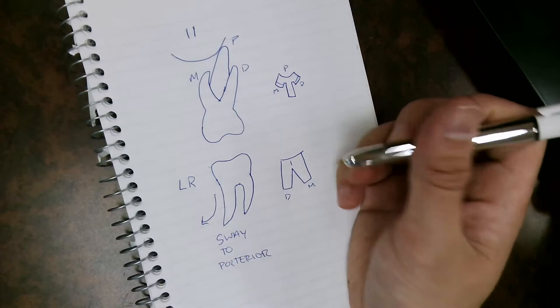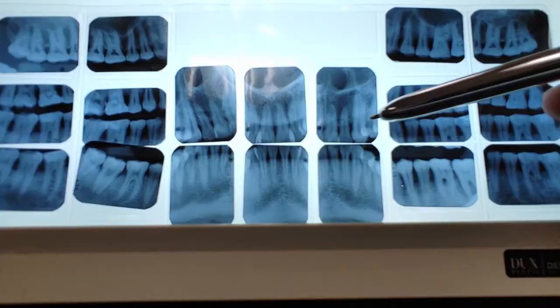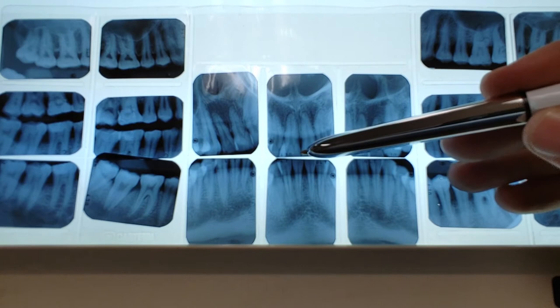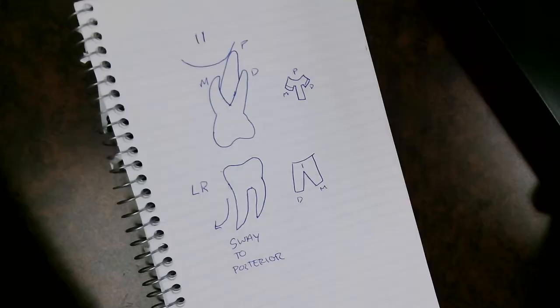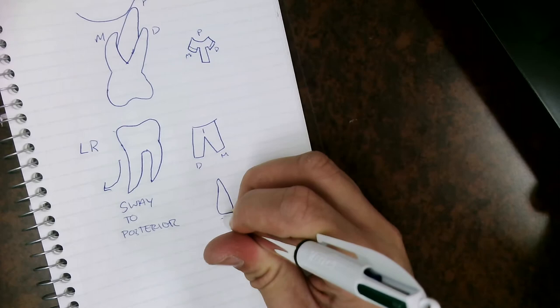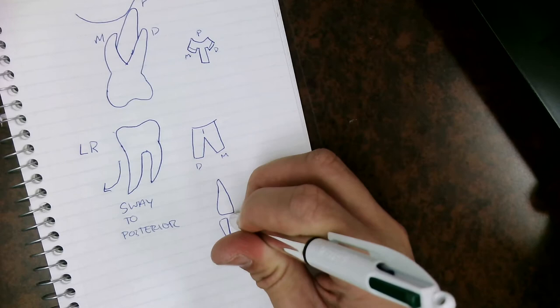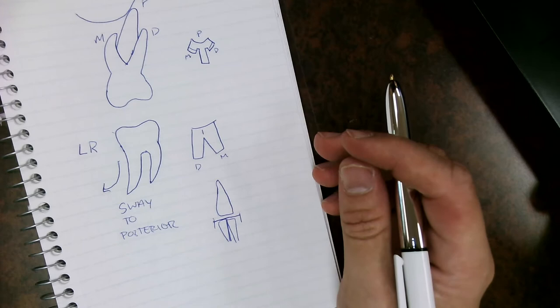That's something to remember when deciphering shirts versus pants, or top versus bottom. Another thing to look at in the anteriors is the width of the tooth. On the bottom teeth, they tend to be smaller in width; the top teeth tend to be larger. For example, one maxillary incisor is roughly equal in width to about two mandibular incisor teeth combined. So comparing the sizes of the top and bottom anterior teeth will help indicate which are maxillary and which are mandibular.